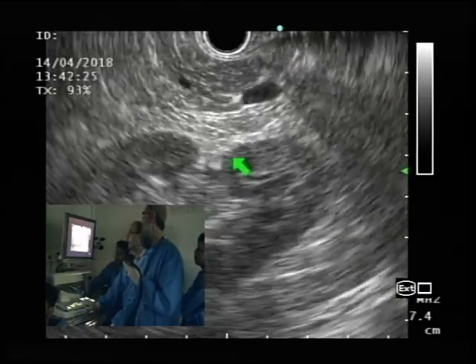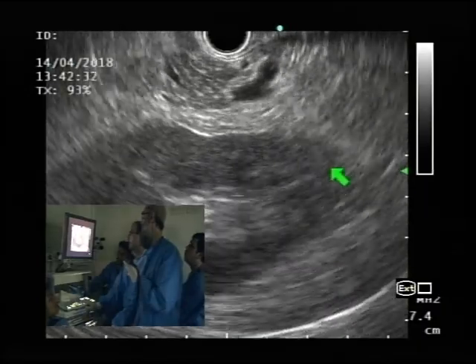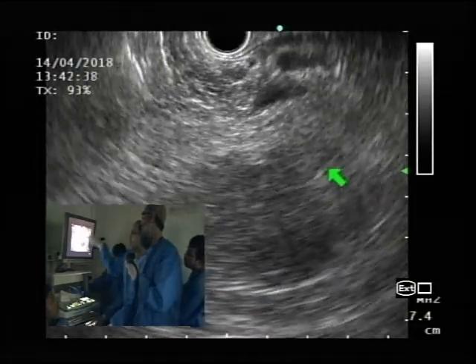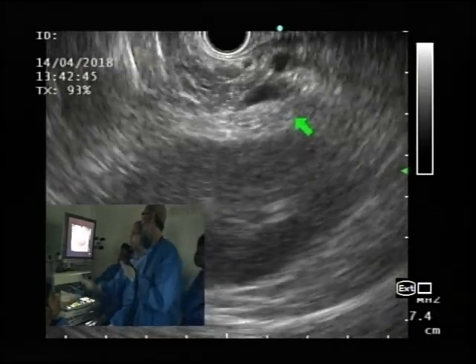And as we do that, the right kidney comes into view. Keep going clockwise. And again, if it's getting away from you, you have to push in a bit to get close to it. So there you go. And now there. Now it's there. So we seem to be losing it there. I don't know if we're compressing it or if that's the end.